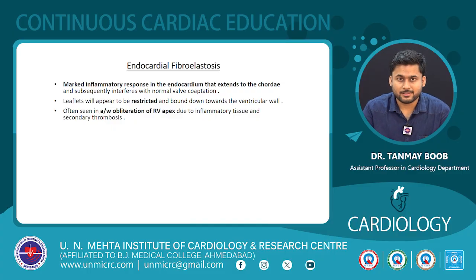The other pathology which we'll be studying is endocardial fibroelastosis. It is marked inflammation in the endocardium, which can extend to the chordae, which will interfere with the normal valve coaptation. Leaflet will appear to be restricted and bound towards the ventricular wall. It is often associated with obliteration of RV apex due to inflammatory tissue and secondary thrombosis.